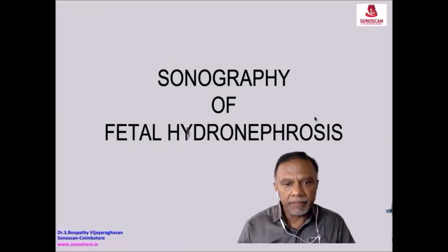Hi, this is the preview of the lecture video on sonography of fetal hydronephrosis. The various snippets of the topics covered under this lecture video will follow.